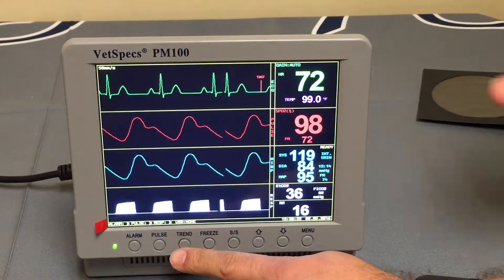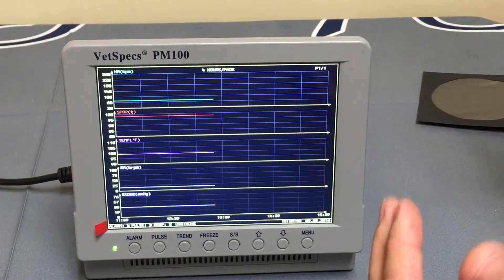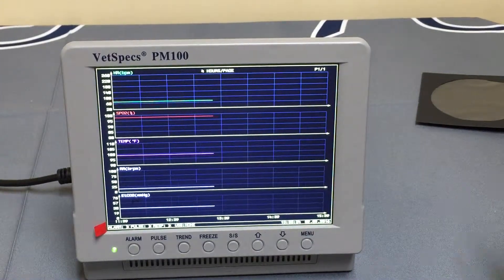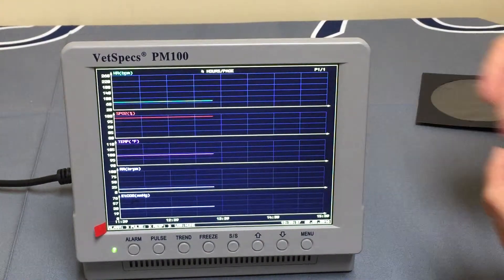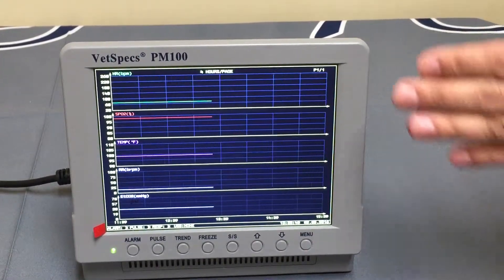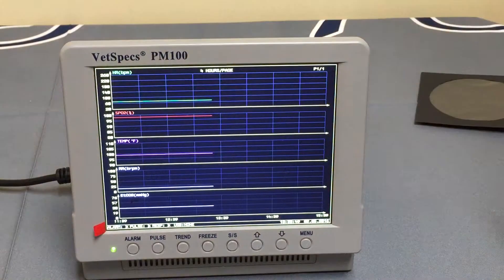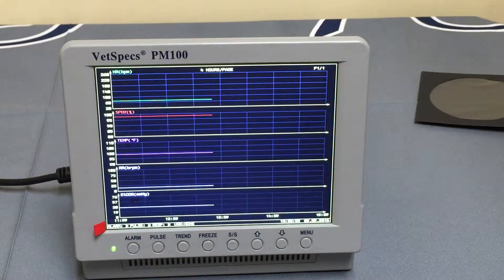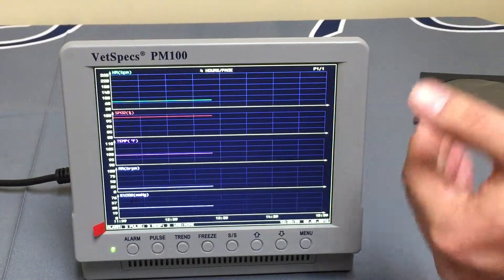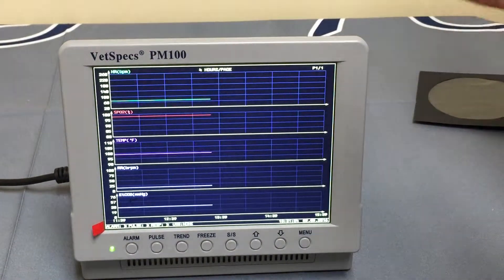By pushing the trend button, even during surgery, you can view a summarized chart of the streaming data — heart rate, temperature, respiration, and end-tidal CO2 — on a single chart within the internal memory. This allows the doctor or technician to quickly view what the trend has been throughout the duration of the procedure. The trend chart continues indefinitely for as long as the procedure goes on. It is temporary in the sense that if you power the monitor off, this trend is cleared.